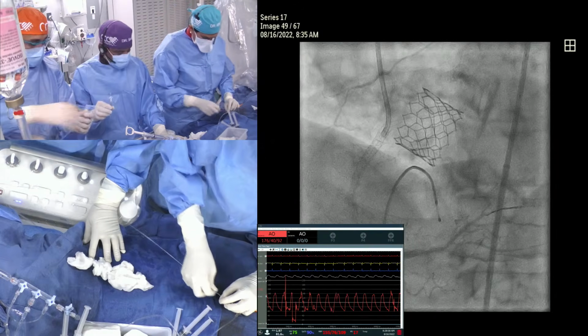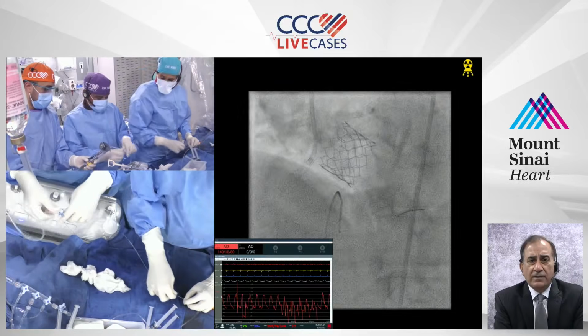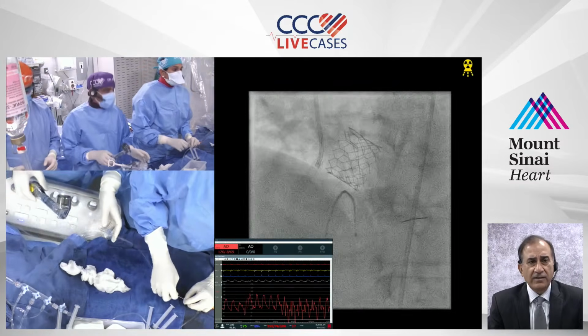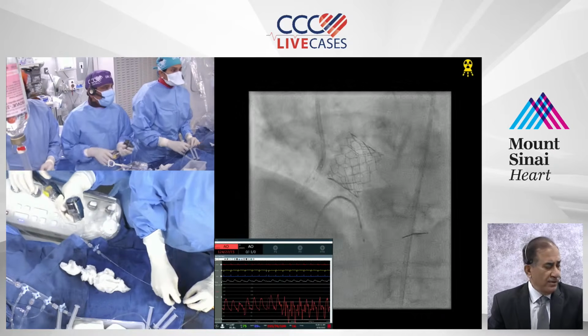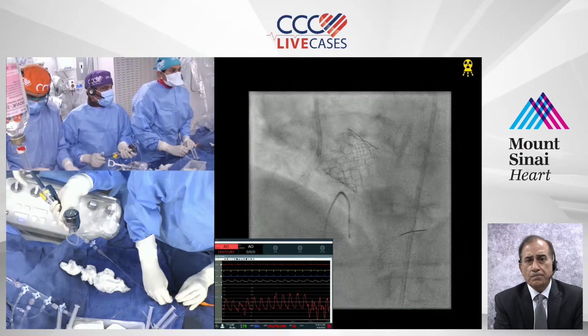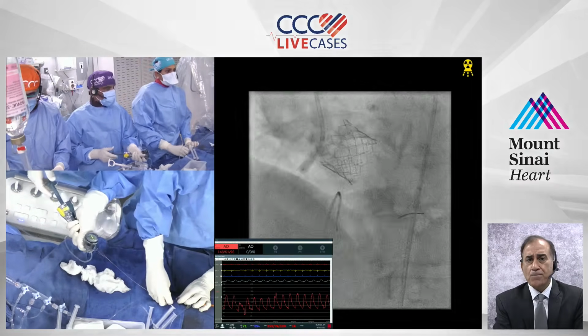So, the segment of the vessel after the newly implanted stent, do you think that needs to be expanded also? Yeah, we'll do this one now. Let's do this first. Do you want to go a little distal at the edge? No, I mean the overlap. Yeah, we'll do the overlap. Definitely. Okay, here. 20 atmospheres. Yeah.